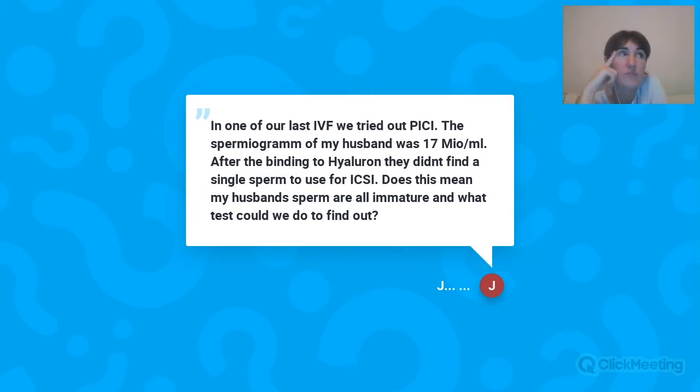One way you could try, if this problem is so severe, it might be that the sperm cell is not molecularly correct. It might also be that it has been damaged at some point of the process.